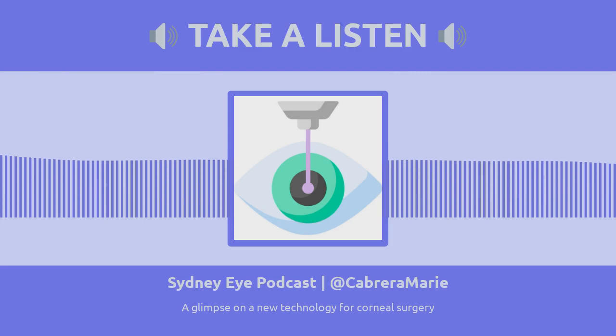I mean, for me, I'm a novice surgeon. Stephanie, my supervisor, could do it much quicker. Takes me about 2-3 minutes at a minimum, one suture. Whereas the patch, I just put it on, laser it. Before I know it, they're done.